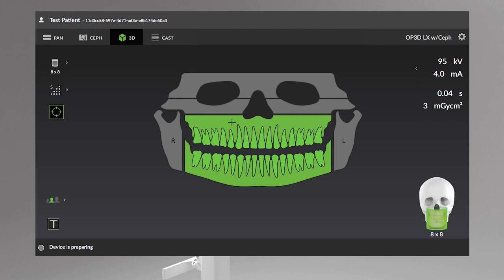You can select all parts of the dentition by double-clicking any single selection, tooth, jaw, or TMJ. Undo the Select All by double-clicking the selection to return to the previous state. Clear all selections by clicking the gray area on the lower corners of the dental chart. Undo the Clear All by double-clicking the gray area to return to the previous state.